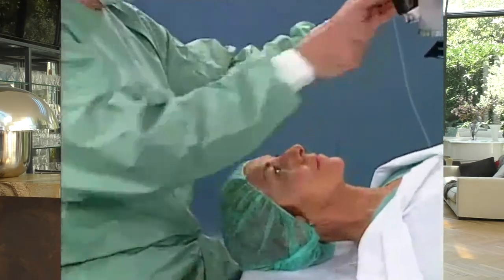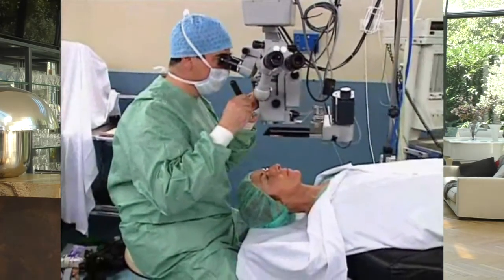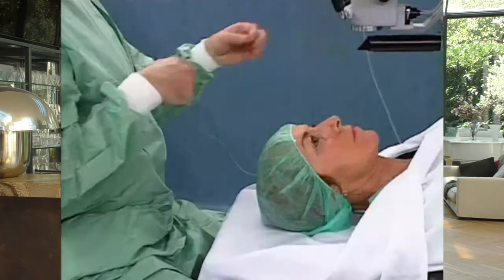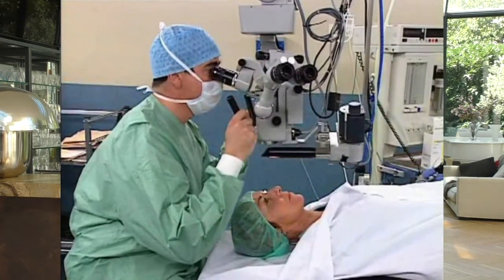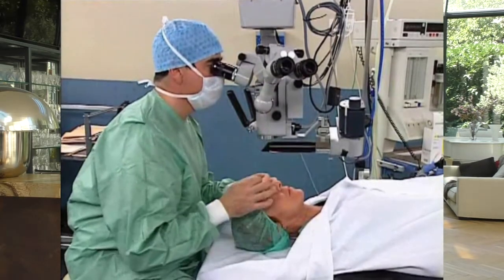Make sure that the patient's head extends slightly beyond the headrest. If the head is placed further back, the risk for the surgeon is to bend forward and perform a cervical lordosis, the harmful effects of which will be seen. And this brings us to the subject of the surgeon's installation.